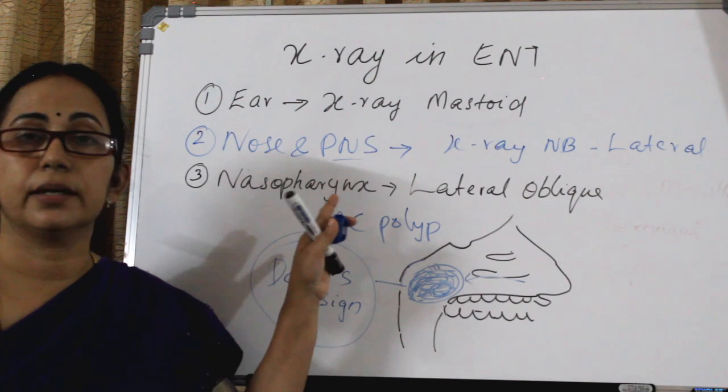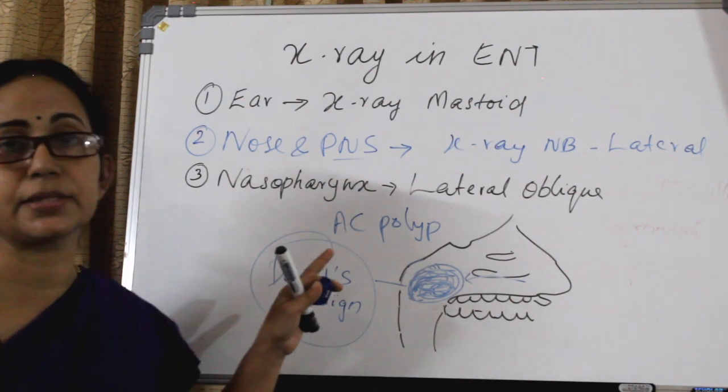Regarding X-ray nasopharynx, let us see some X-rays. Do not call it an X-ray nasal bone or X-ray skull. This is X-ray of nasopharynx. This is a case of an eight-year-old girl complaining of recurrent snoring and mouth breathing. This is X-ray nasopharynx lateral view, which is used to grade adenoid hypertrophy.